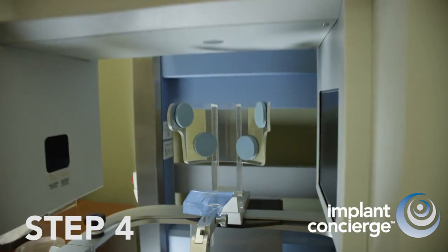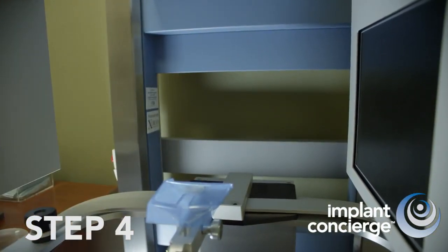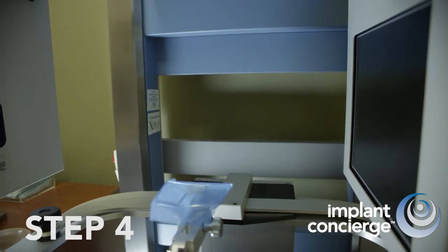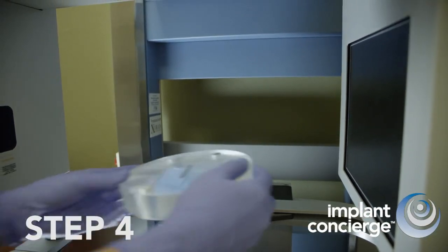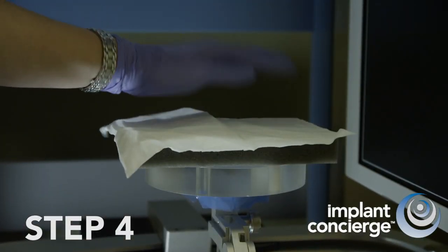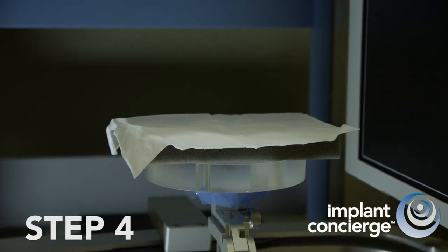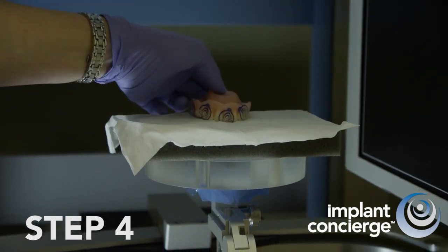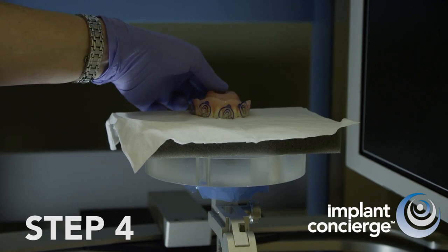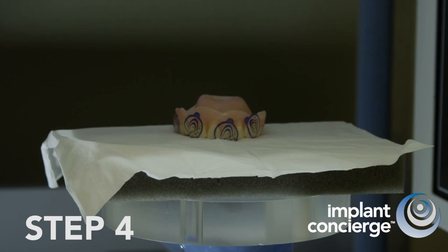Step 4. Prepare the Cone Beam CT unit for an object acquisition scan. Each manufacturer provides a specialized surface or platform for a denture scan. Place a foam block on the Cone Beam CT platform to create space between the denture and the platform. Then, place the denture with the x-ray markers on the foam block in the same orientation as it will be worn in the mouth. For example, because this is a maxillary denture, the teeth are down.